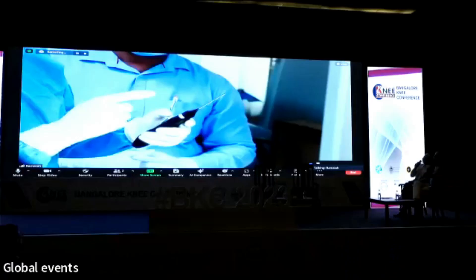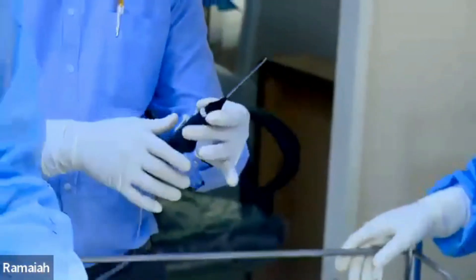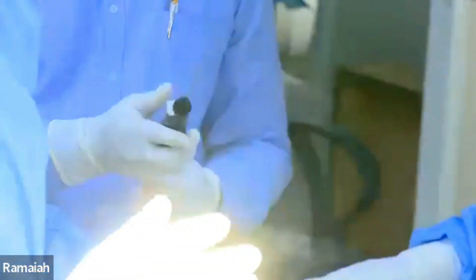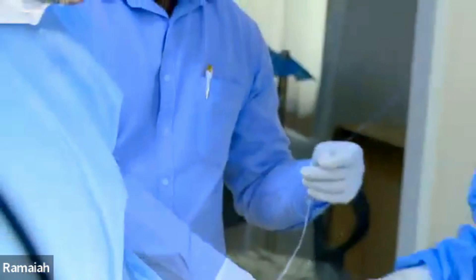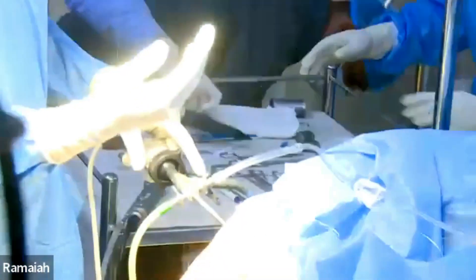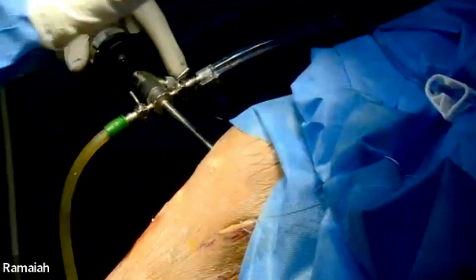The needle is very sharp and it can pierce tissue quite nicely. The next aspect — and what worries me about inside-out meniscus repair — is damaging structures. On the medial side, I'm worried about the saphenous nerve. If you are going posterior, we don't usually employ this technique for the very high posterior of the medial meniscus because of fear of the main vessels and nerves. We employ it for the posterior medial aspect, not for the total posterior aspect.